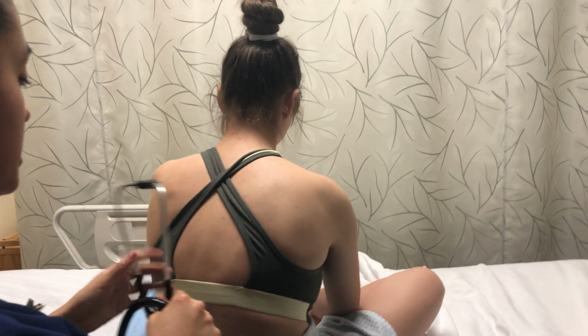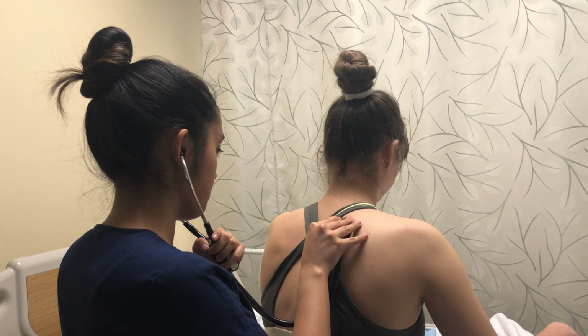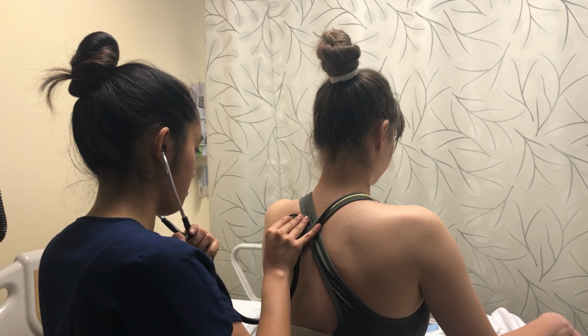I'm going to go ahead and listen for any crackles or adventitious breath sounds again, and breathe as I place the stethoscope.